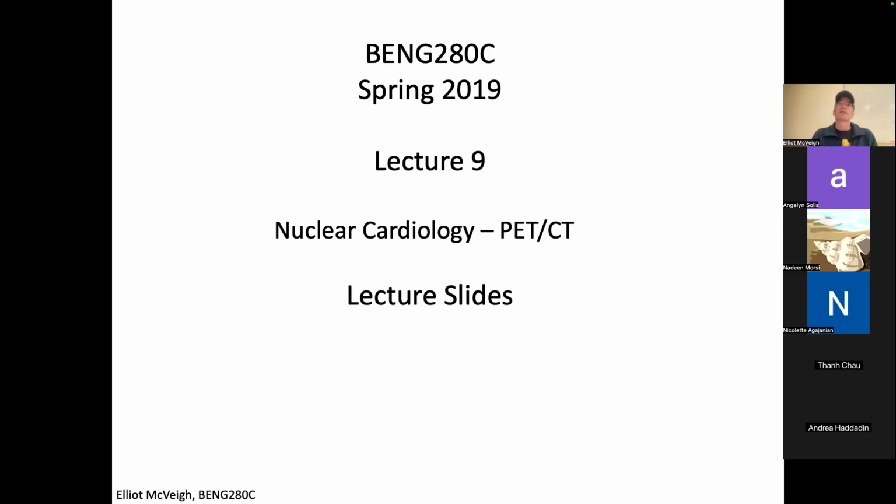And the nice thing about PET is the data can be acquired more rapidly, and the spatial resolution, as we'll see from the technique itself, is higher because you essentially have a very thin line of sight or line of activity from which your signal could emerge when you detect it. And we'll see. So it's a really interesting technology.